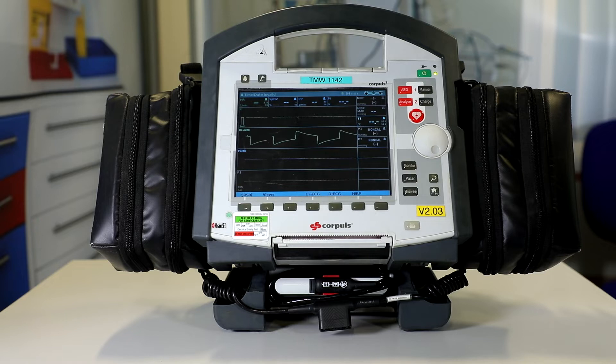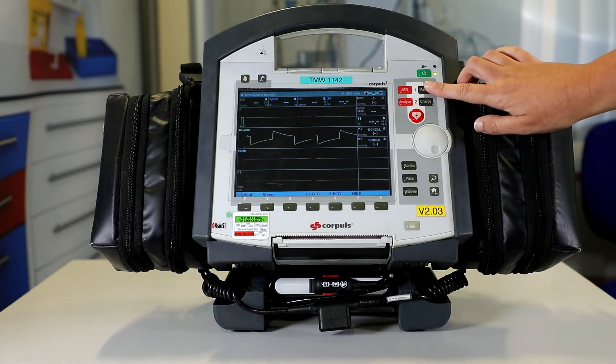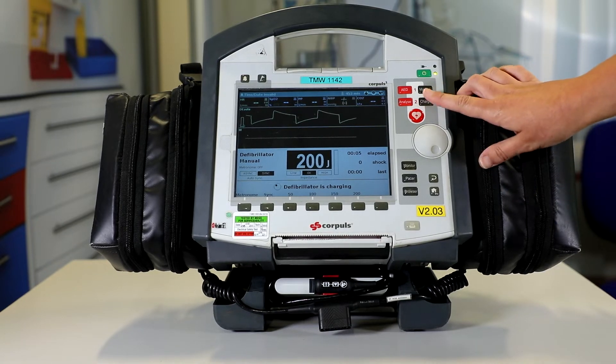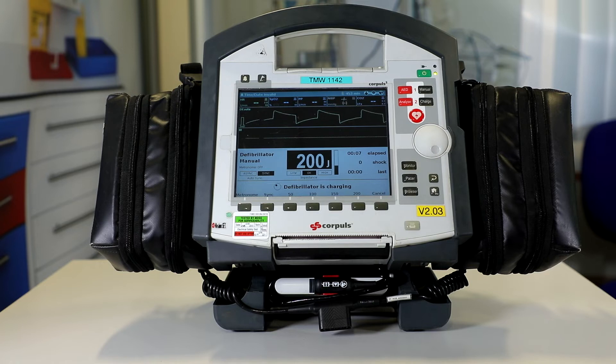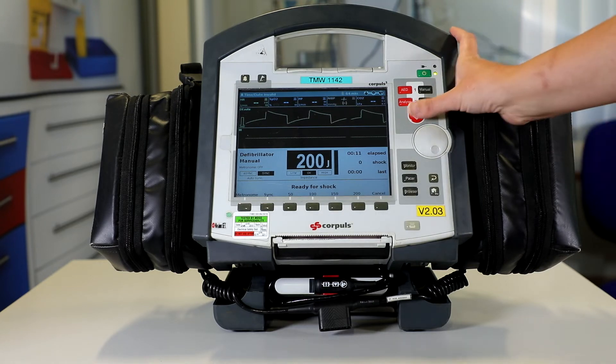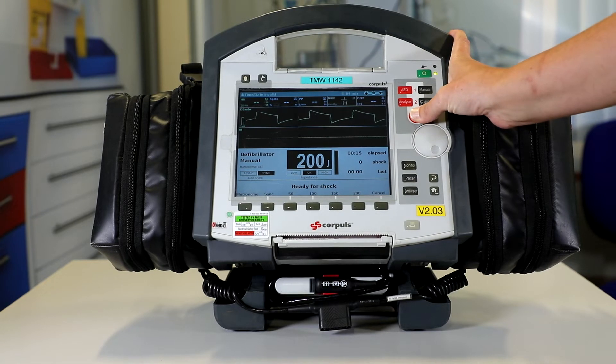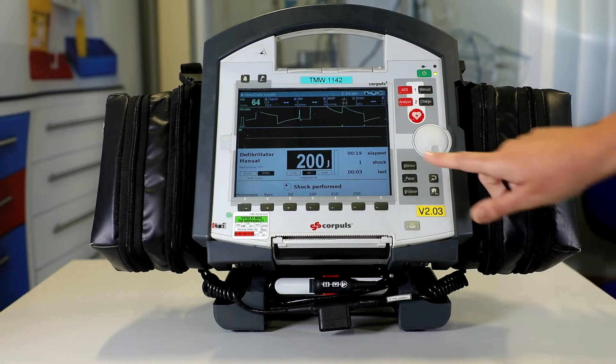The next is check 2. We select manual, press charge to load the energy to 200 joules using the charge button again. Once charged, this time we deliver the shock — press and hold the shock button, which is this large red button here — and check that it was released with no error. We come off this screen by pressing the monitor button.